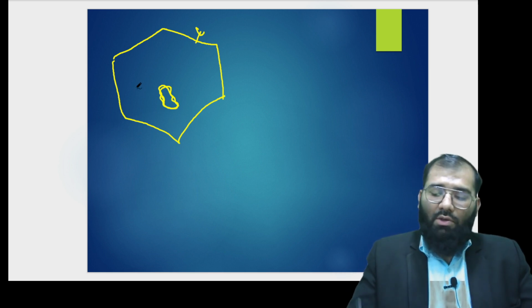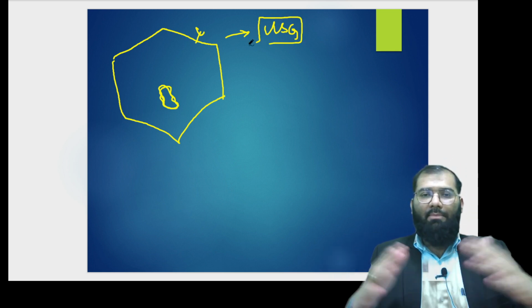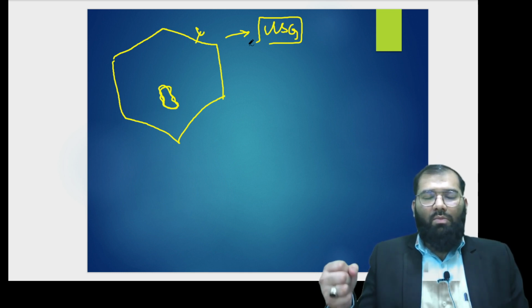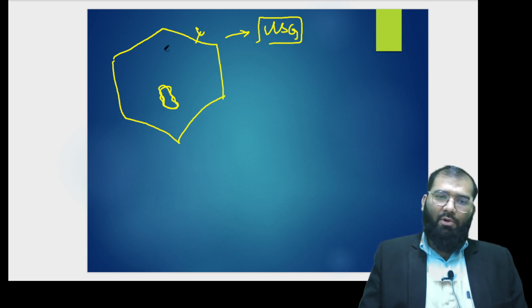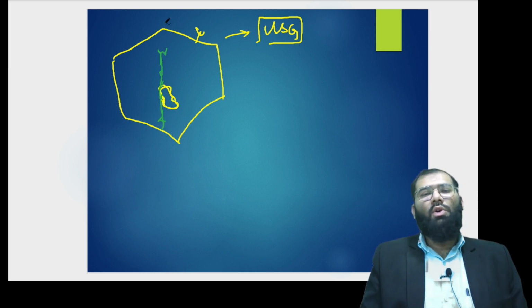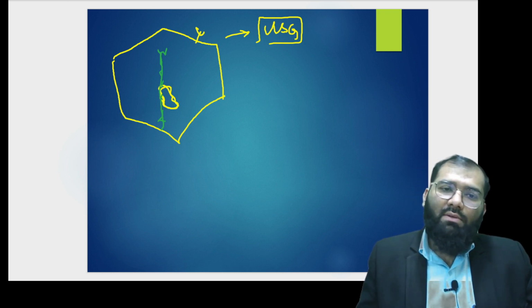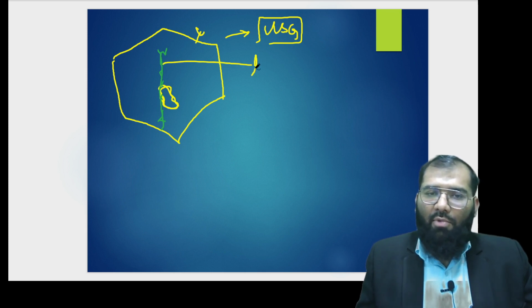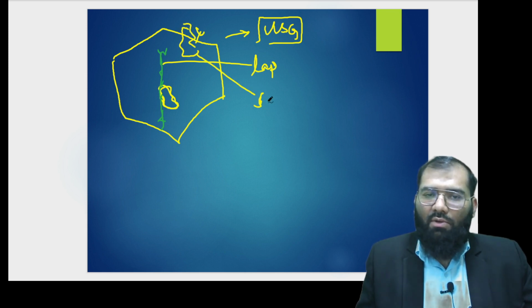So I decided, let's call the patient and do an ultrasound. We called the patient and exposed her abdomen for the ultrasound. As I opened up the abdomen, we saw that there was a big laparotomy incision. I asked her what surgery she had already undergone. She told me that she underwent a laparotomy for a trauma years back, and she doesn't remember exactly what happened. But I understood that the laparotomy was done after trauma, so they must have found that the spleen was shattered and removed it, so a splenectomy was done.